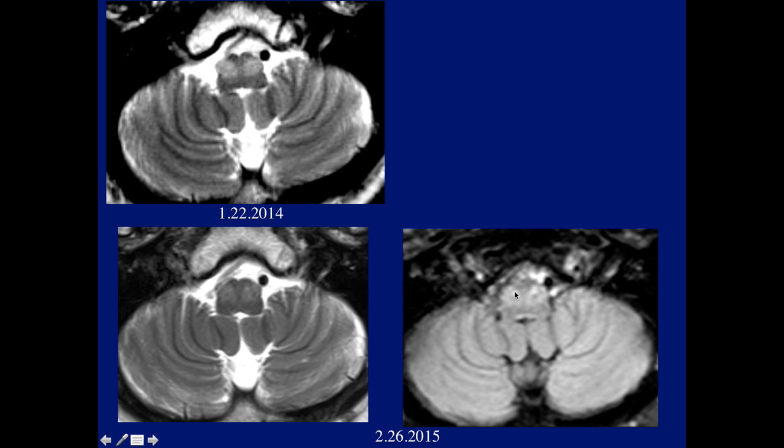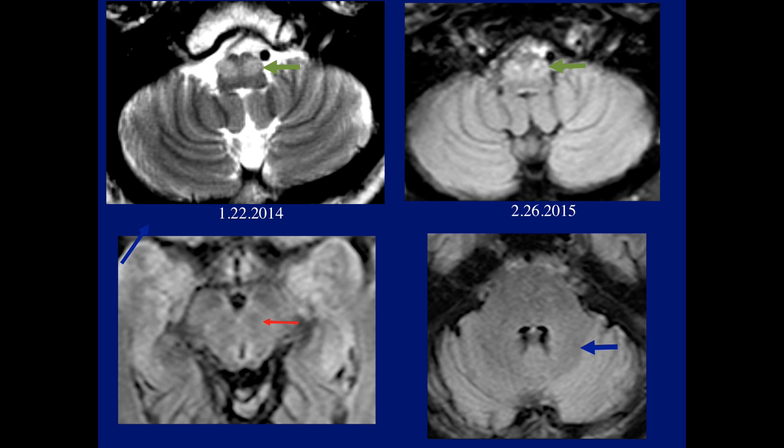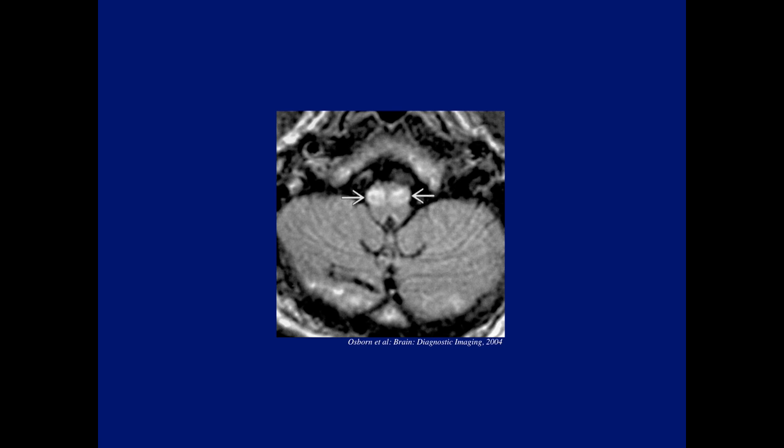It was not clear why the patient had that because we could not find anything else — the region of the dentate looked okay, the red nucleus looked okay. Also in the literature, here's another case where both olives are involved; however, this patient had a large prior pontine hemorrhage, explaining why both sides were involved.